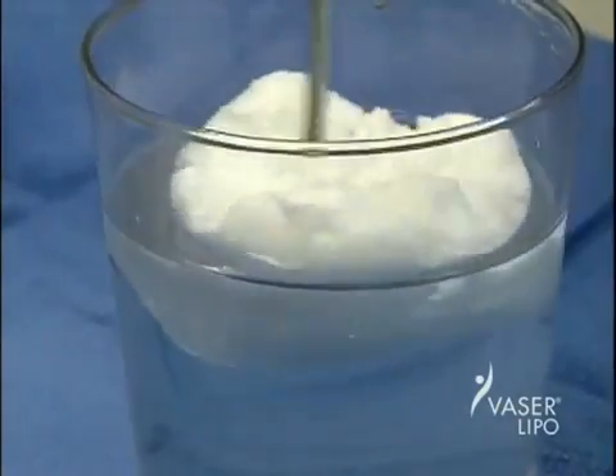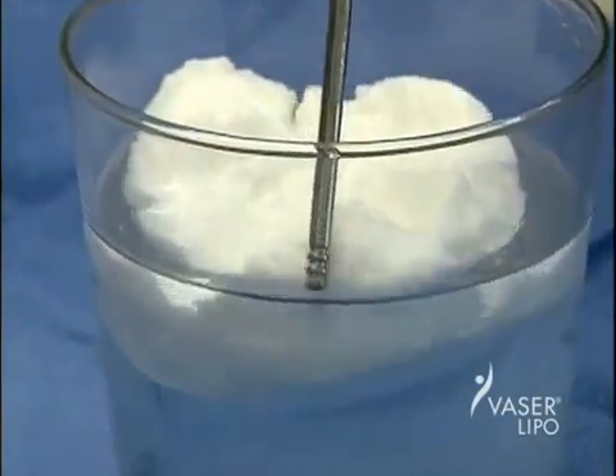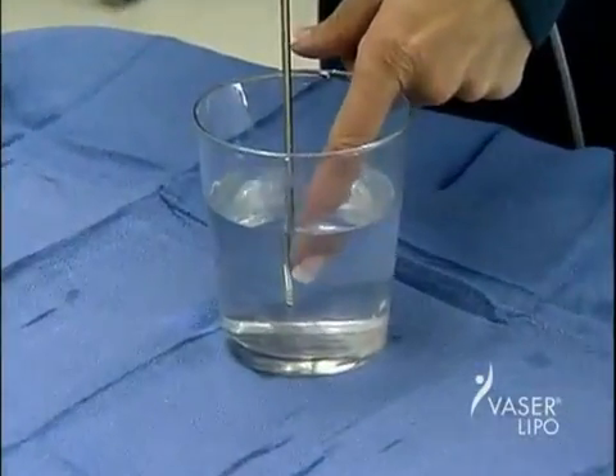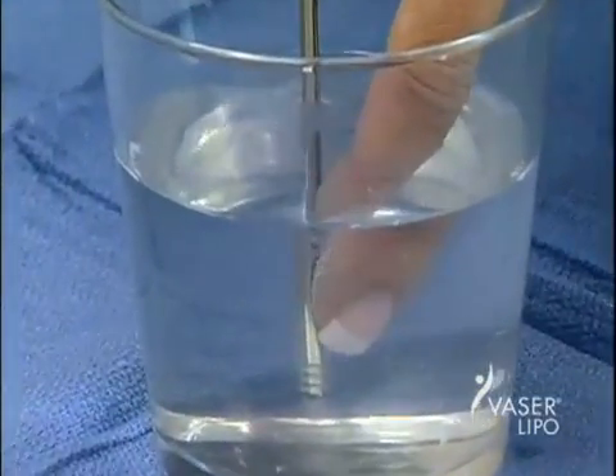Let's look at how fat reacts to VASER ultrasonic energy. Here we see how a lump of shortening suspended in a jar of water is instantly emulsified when ultrasonic energy is applied through a specially designed probe. This is the same way the fat cells in the human body react to ultrasonic energy. Yet you can see how this gentle energy comes into direct contact with a finger without causing harm.